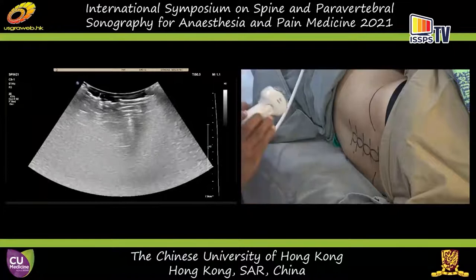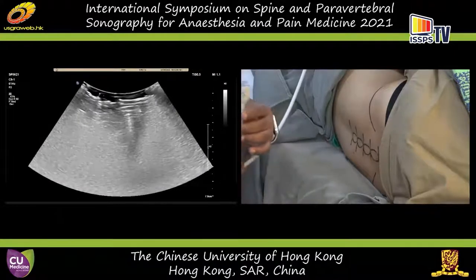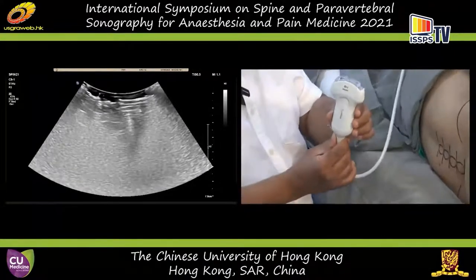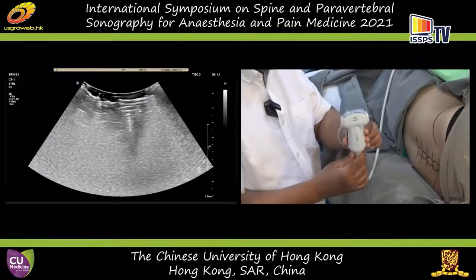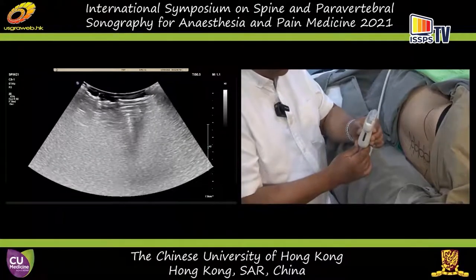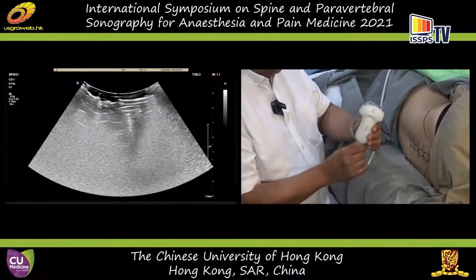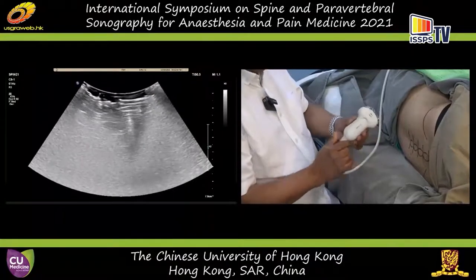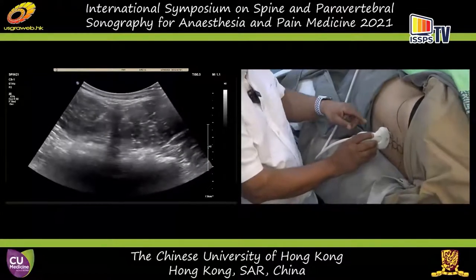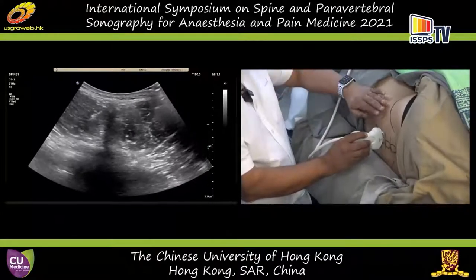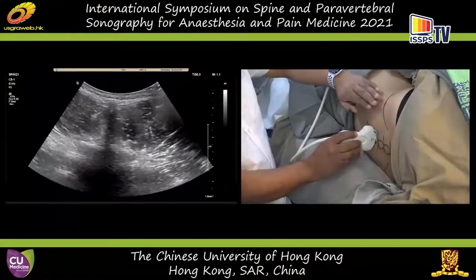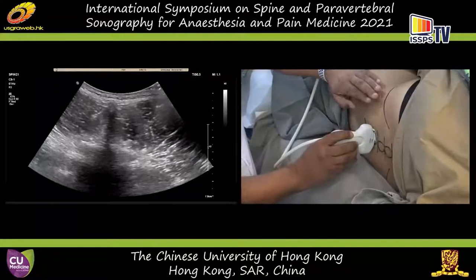First of all, this is a curved array transducer. It is five to one megahertz. And for this demonstration, when I perform a transverse scan to represent the right side of this volunteer.